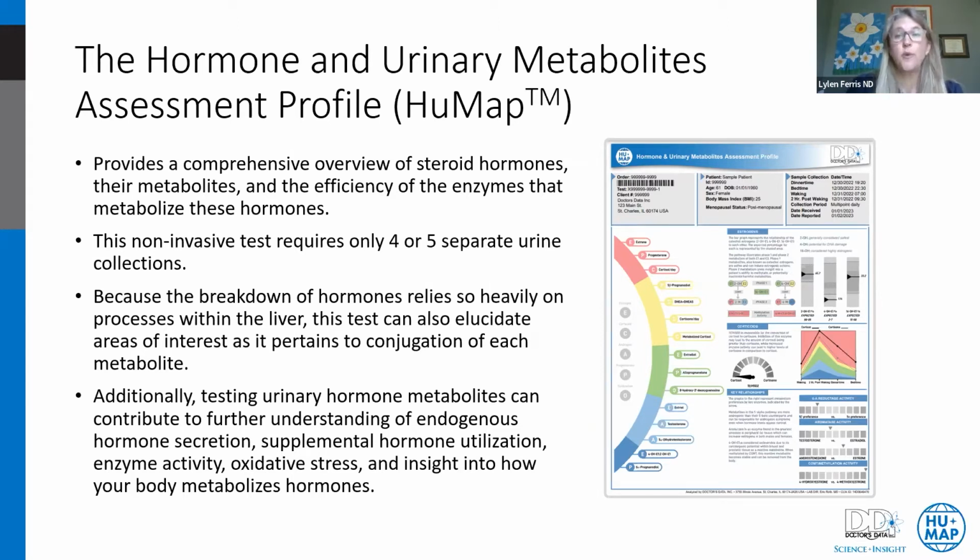This test is appropriate for males and females. Keep in mind there are no reference ranges for prepubescence. So males under 12 and females who have not yet started menstruating are not good candidates for this test.